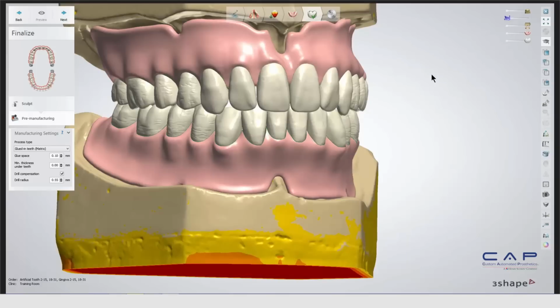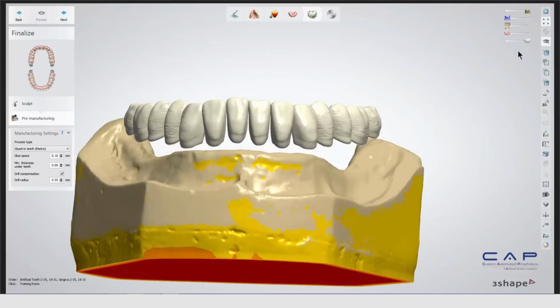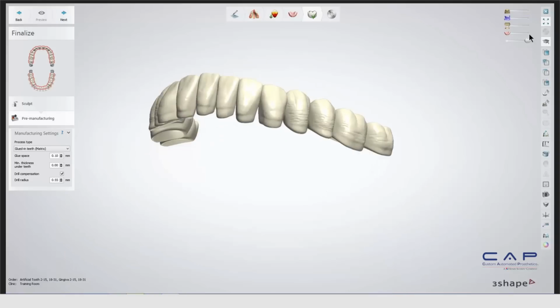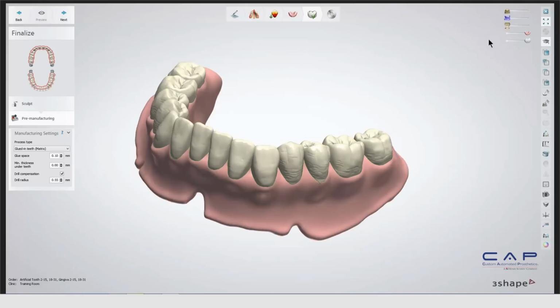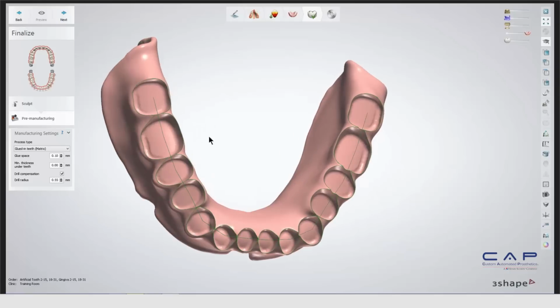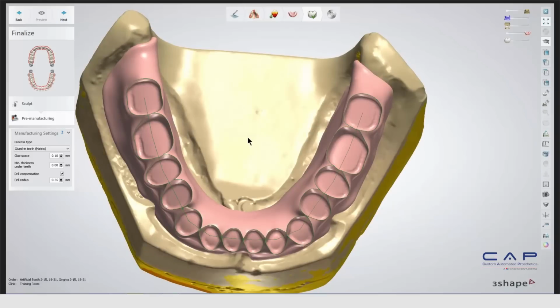Yeah. Okay, let's go back to see where Matt is at. And we'll get to more questions in a little bit. So we'll take a look at what this looks like here, and you can see the underside. This one did not need to be milled on the underside because of that instance, but we can look at how this is sitting in there. You can see the keying system that it has based upon those denture teeth. So this base now can become an STL file that can be printed or milled.